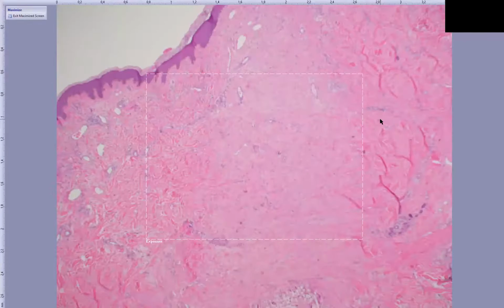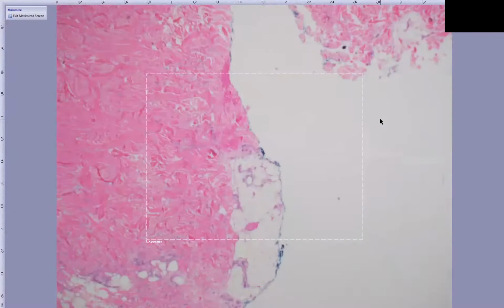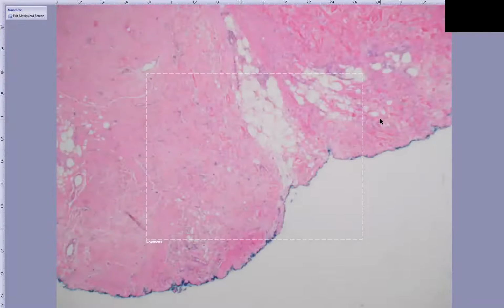Okay, this is another example of a foreign body granuloma. So we've got an inked specimen, indicative of an excision specimen. So right away, you know, okay, this might be a re-excision of something. You can see the scar. But down in here, you can see some ovoid-shaped structures.